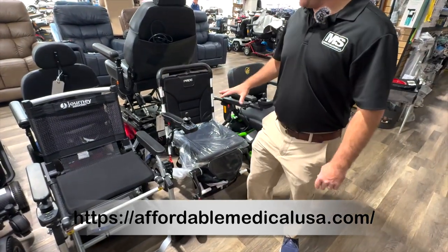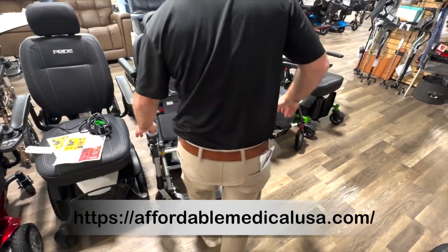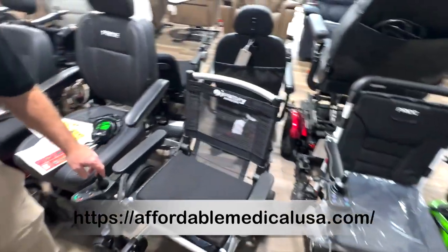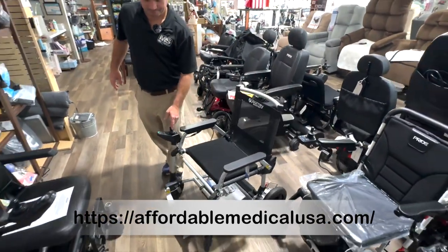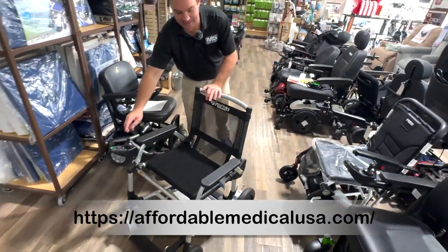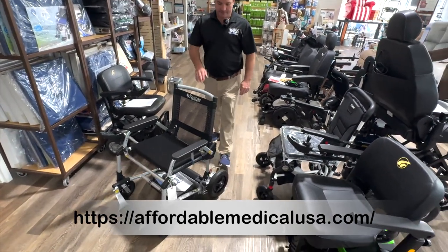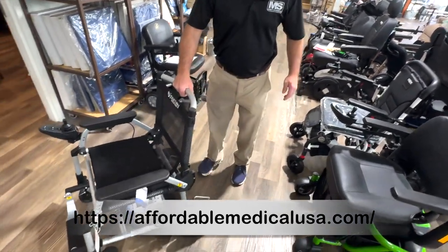This is about 40 pounds. Let me show you something about this chair. Now I don't know if you're going to want to do this every single time, but if you had to, it gives you the option. It's kind of like a lawn chair in a way.